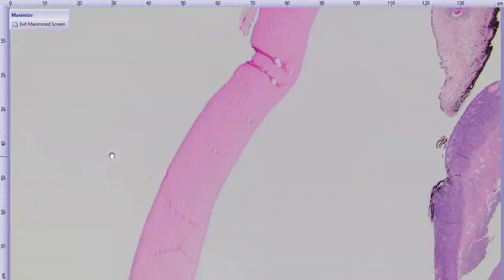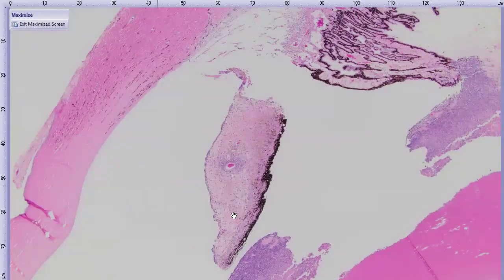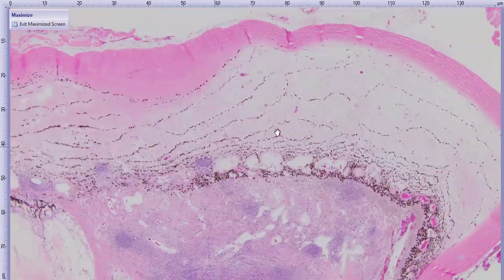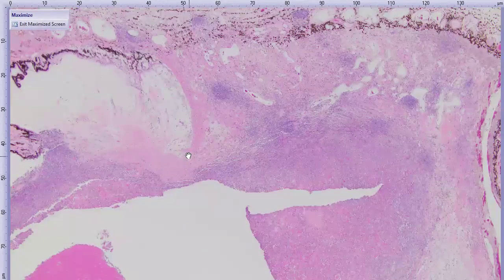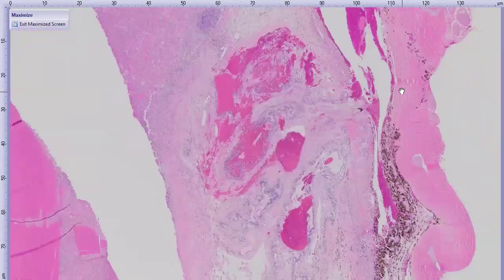So, as I mentioned, from subgross, the cornea was fairly unremarkable. We do have the anterior uvea here. There's some moderate number of lymphocytes and plasma cells in here, which we can also see in the choroid, which is also expanded by edema and some clear space. And then what we do have is this kind of fibrovascular membrane that lines the ciliary body and spans the choroid, the epichoroidal space.